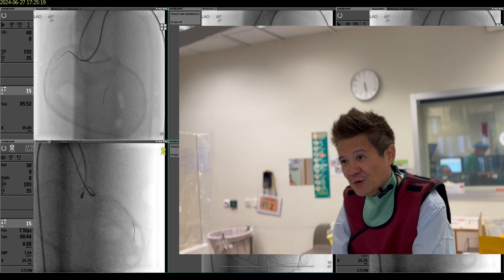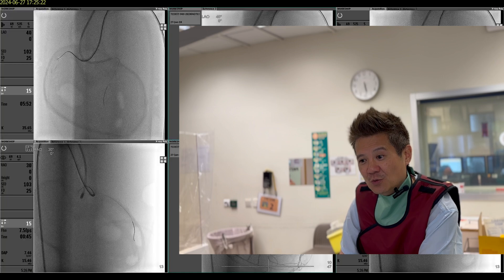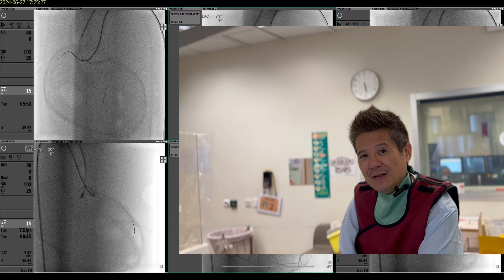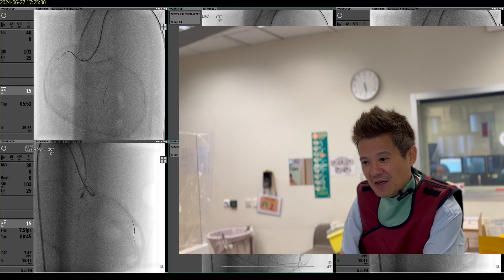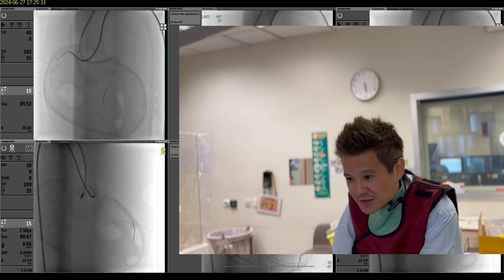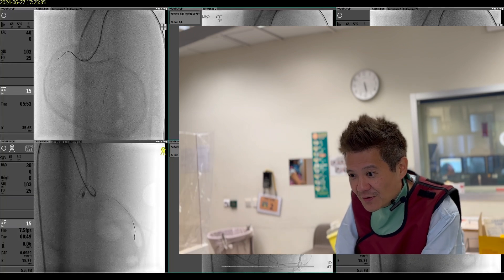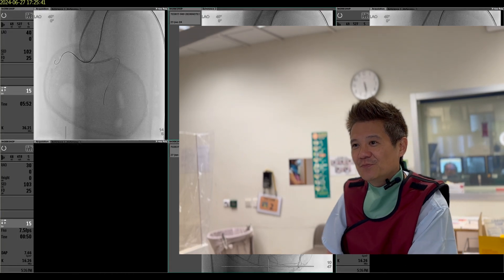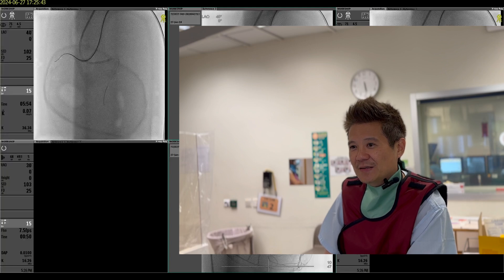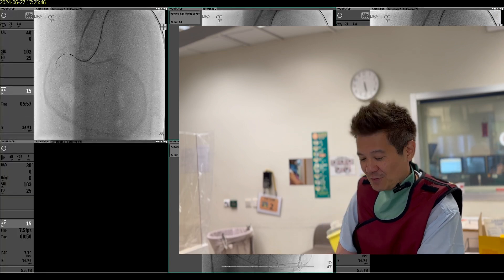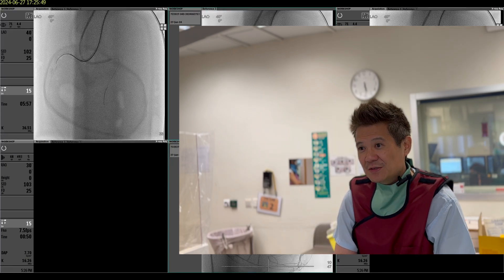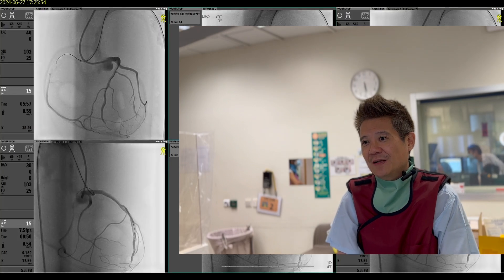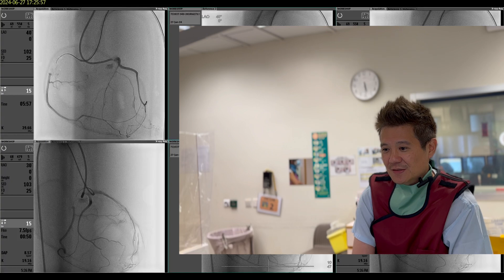Now I want to go to the far view to observe the wire going forward. I'm going to push and turn the wire at the same time — 44 degrees, which is seven and a half minutes of clock rotation. The wire has gone forward, but it's buckled. So that's no good — we have to come back. We're somewhere, but we'll take another biplane angle for the retrograde injection to see where we're at.